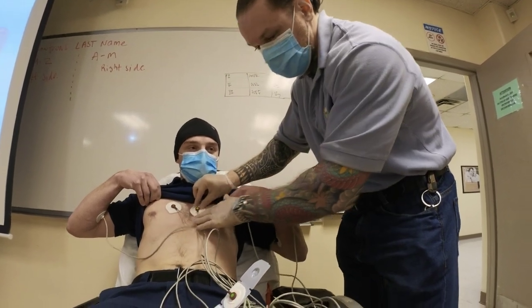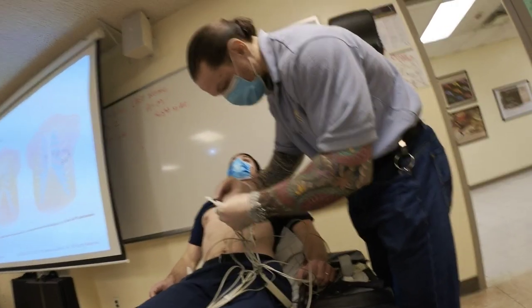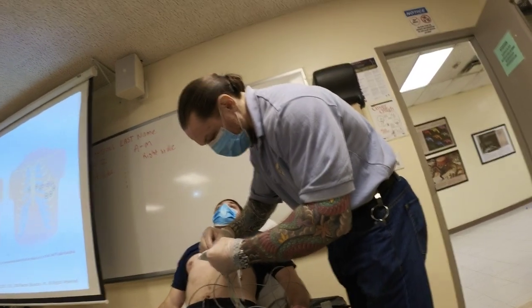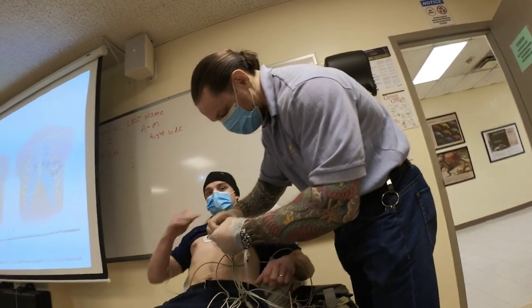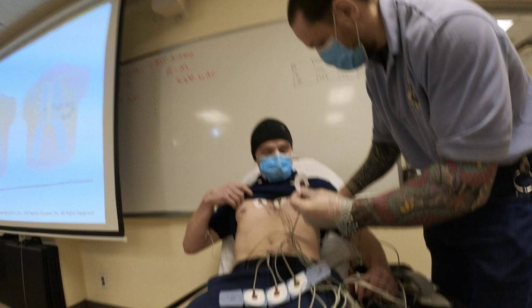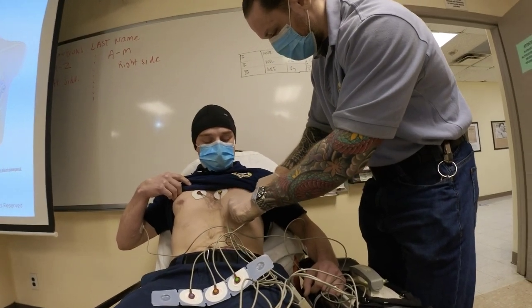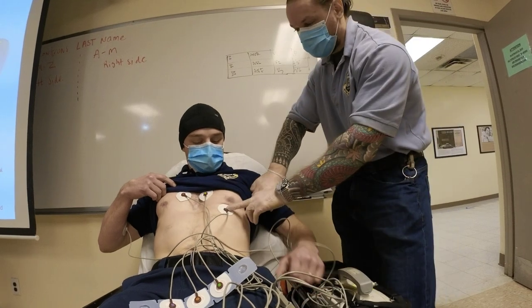The next lead that I take is V4. V4 is going to go below the left nipple. What's the landmark? Fifth intercostal midclavicular. So V4 goes next.